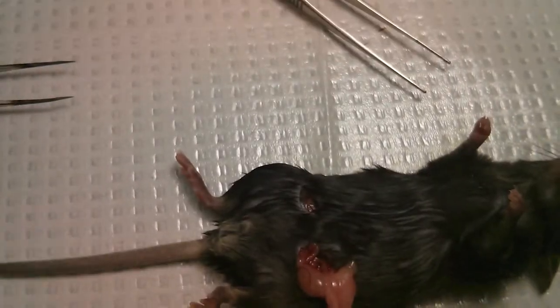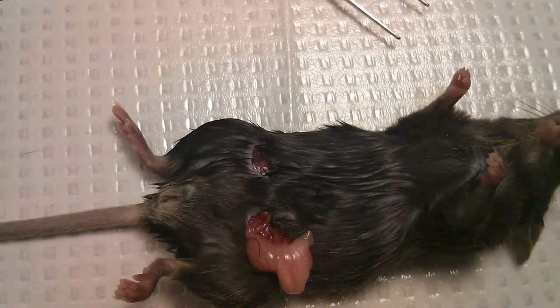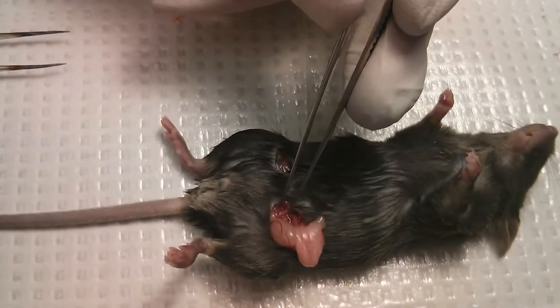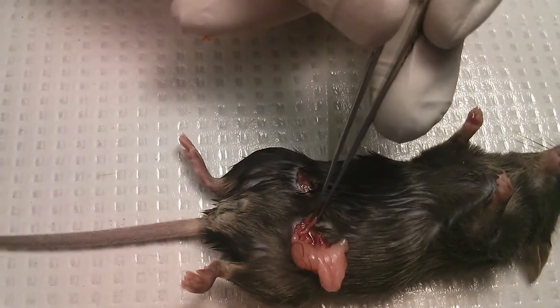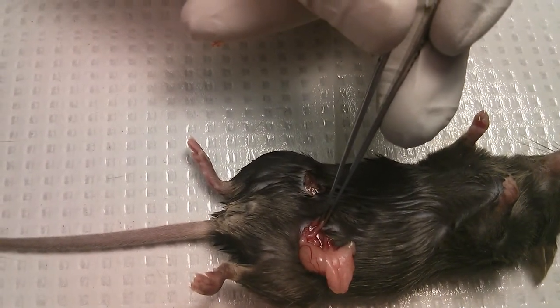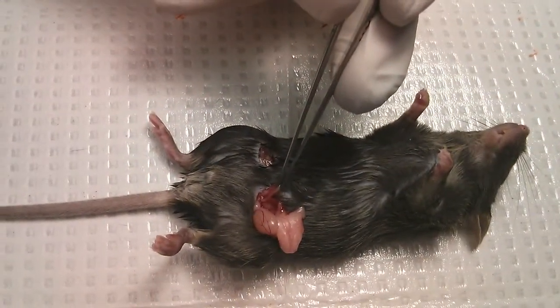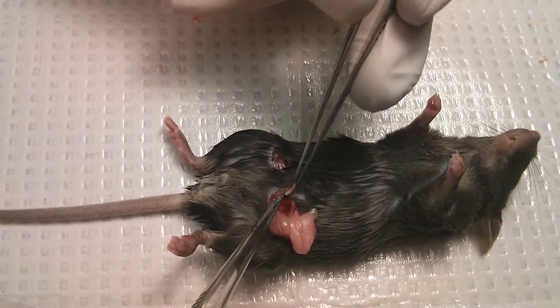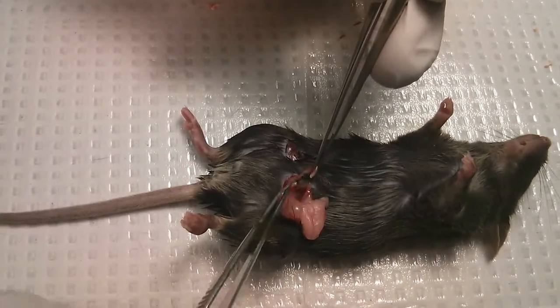At this point, when you find it, you turn the flame on. With one forceps you grab the vas, the other forceps you put on the flame — look at the flame — then you go back and use the hot forceps to seal it. At the same time you cut the vas and you seal it.